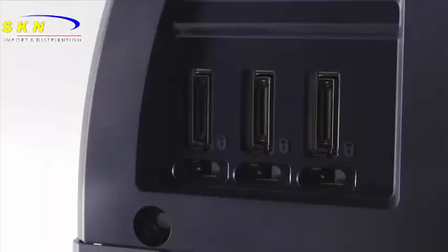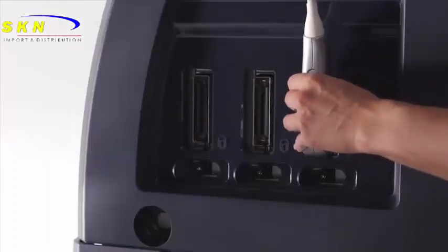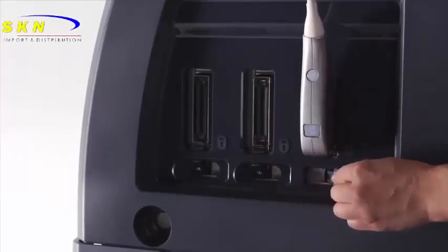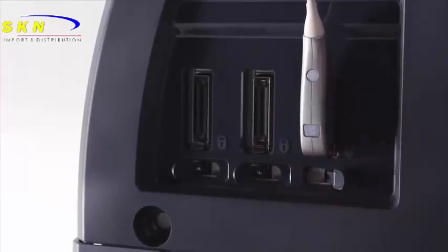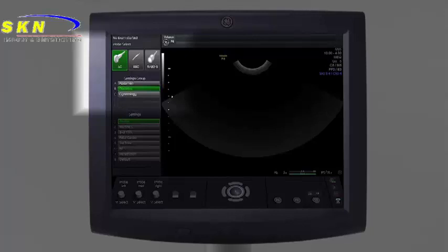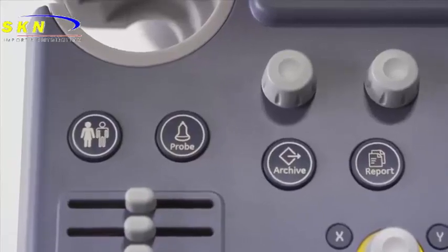To connect a probe, push the connector into place, then flip the paddle switch underneath to engage. Plugging in a probe activates the probe selection menu. All probes currently connected will appear on the menu.